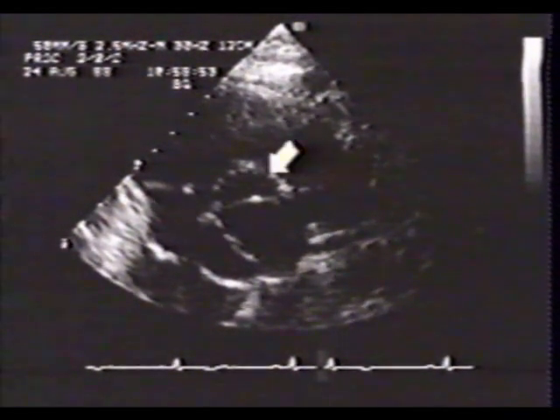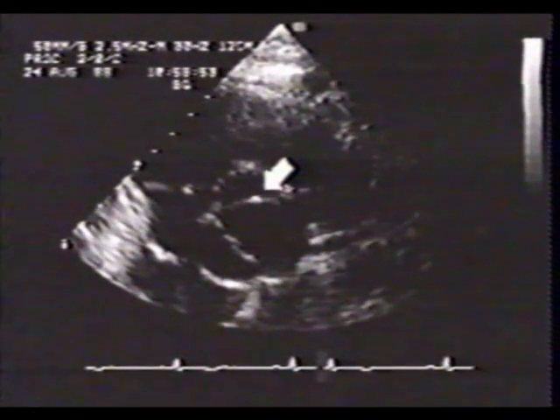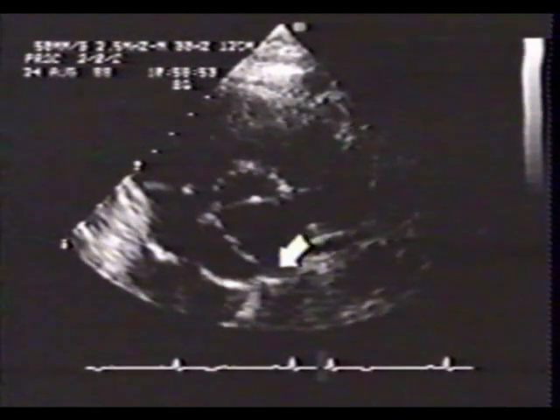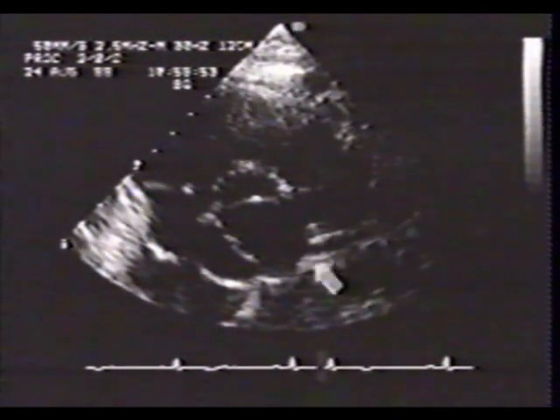This is a parasternal short-axis view of the aortic valve from an 82-year-old male. The coronary sinuses are slightly enlarged. The transducer has been tilted to image the left main coronary.